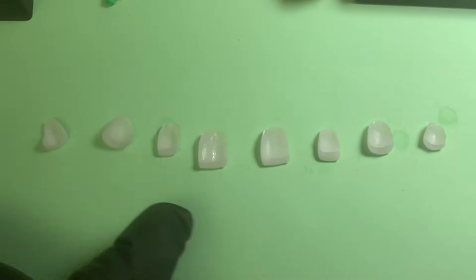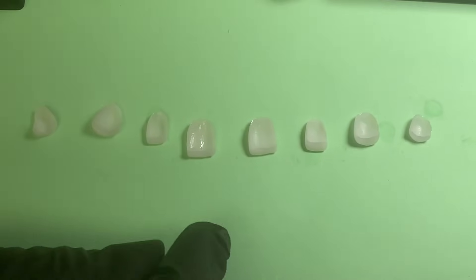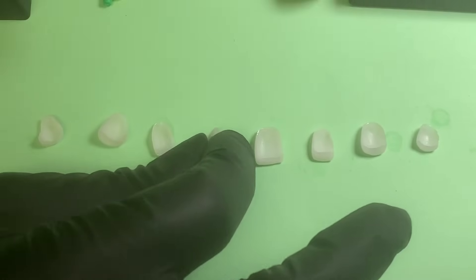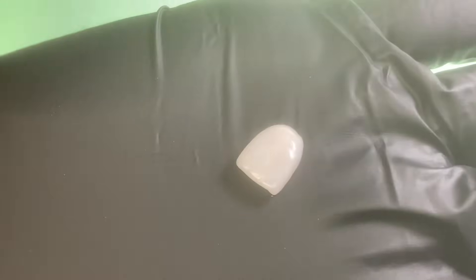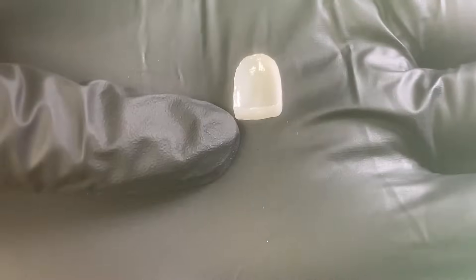Here are the veneers. Basically, they're a thin shell — contact lens thin. This is the front, and it wraps over the edge of the tooth, but doesn't cover the inside of the tooth. So we're going to show you how they're placed.